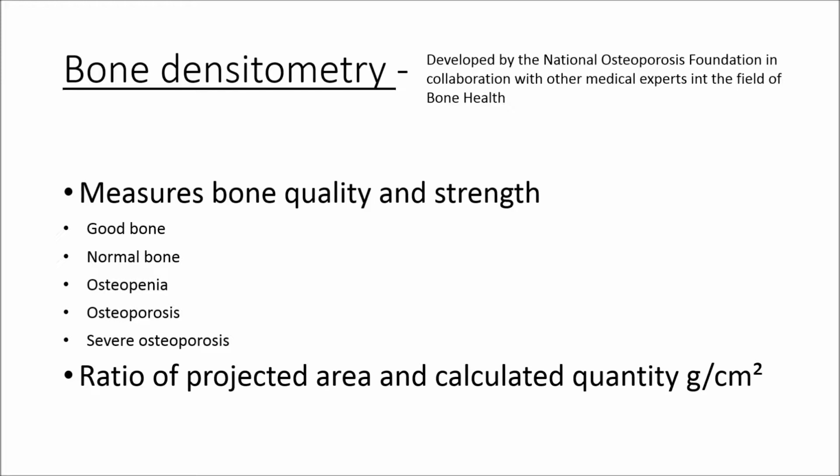This exam uses X-rays to measure the content of bone mineral using a ratio of the projected area and calculated quantity, in units of grams per centimeter squared. The bone densitometry exam was developed by the National Osteoporosis Foundation in collaboration with other medical experts. According to the National Institutes of Health, osteoporosis is a skeletal disorder characterized by compromised bone strength and predisposition to an increased risk of fractures.